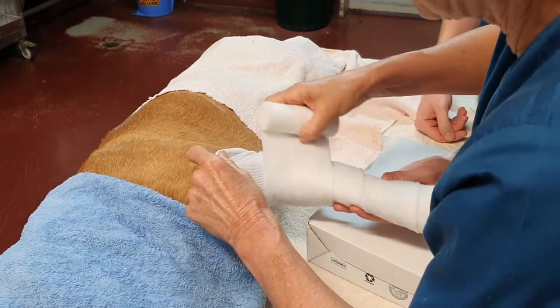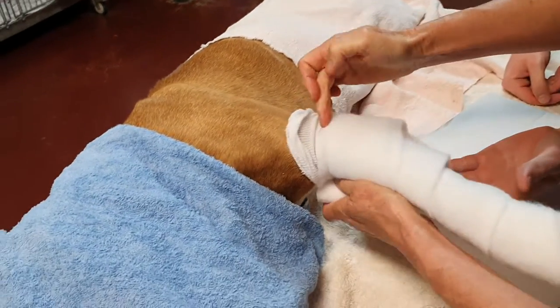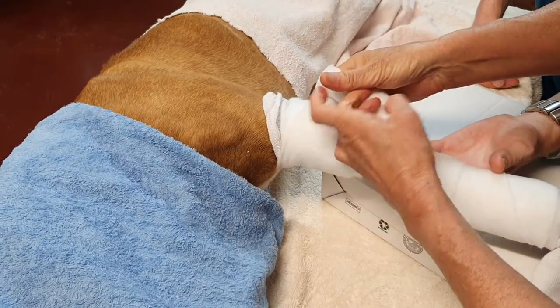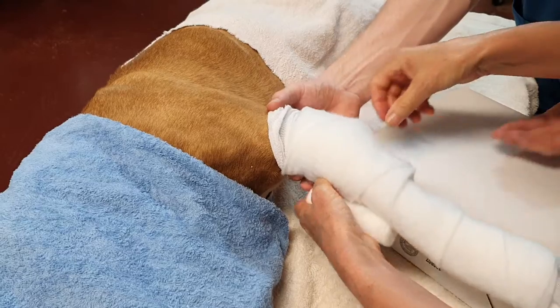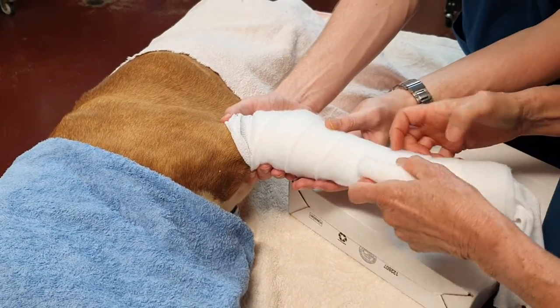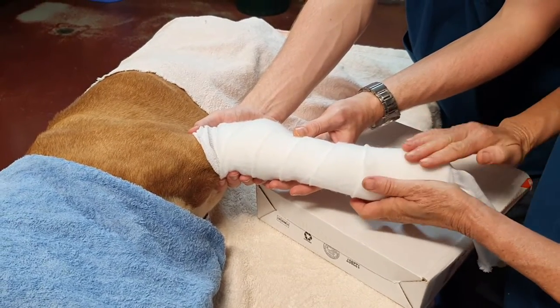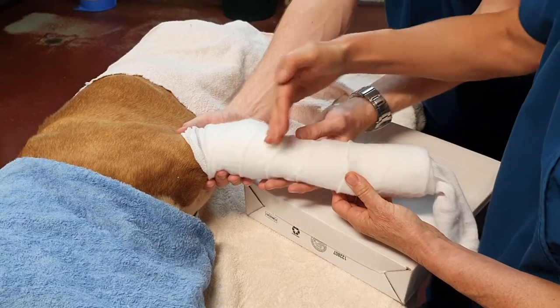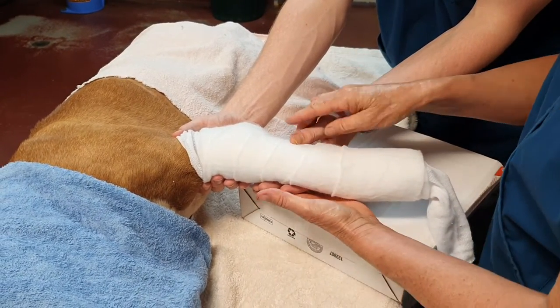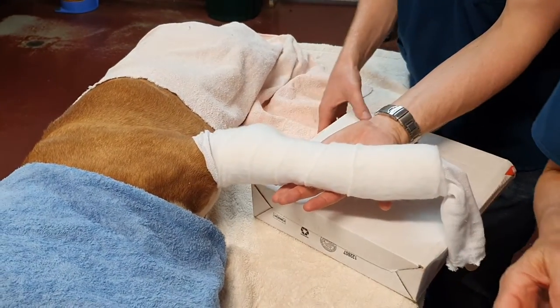Up the top here again I'm going to go two layers of soft band. I'm trying to get a nice, comfortable, bulky top layer to try and prevent rubbing at the top. We'll come back down the leg again, overlapping 50% on the way down. So we've gotten up the leg overlapping 50%, back down the leg overlapping about 50%. My assistant will keep his hand nice and flat so as not to put any dents or pressure sores as we go.